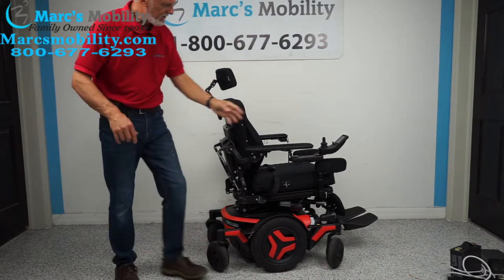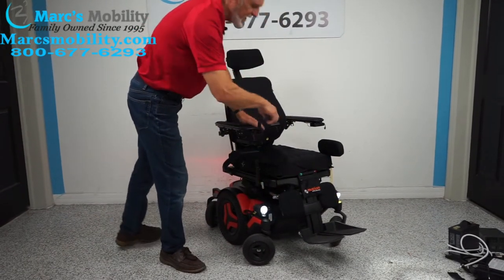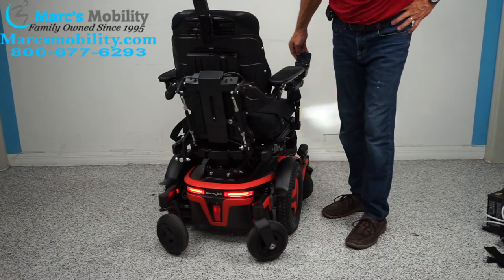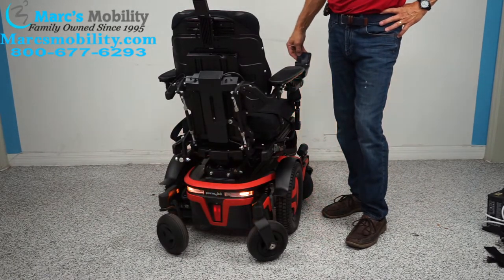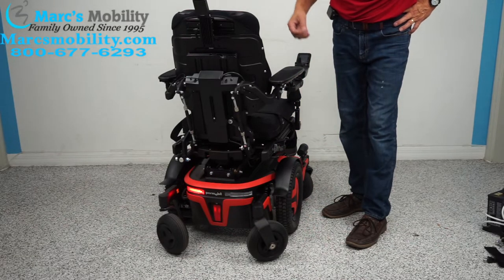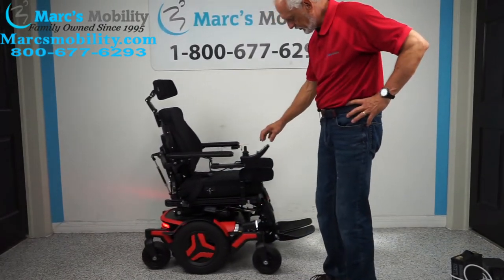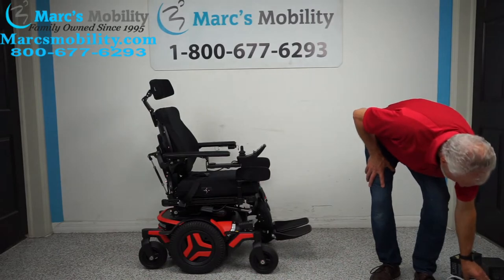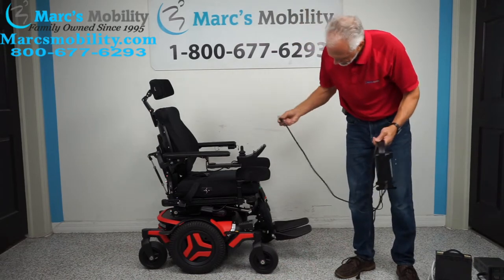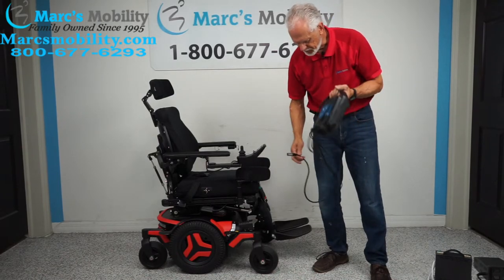This chair has a full package of headlights and taillights — these are the real factory lights. You have one on each side in front, headlights in the back as taillights, and you also have hazards, a left flasher, and a right flasher. When you charge this chair, you use your Permobil charger — it plugs in right here, and as soon as the light goes to full, the smart charger will stop charging.